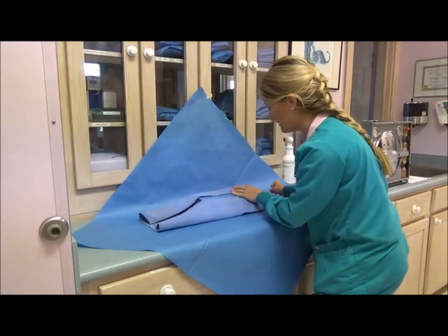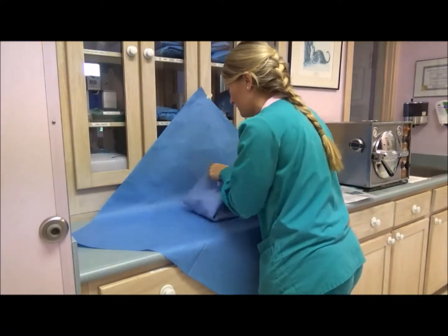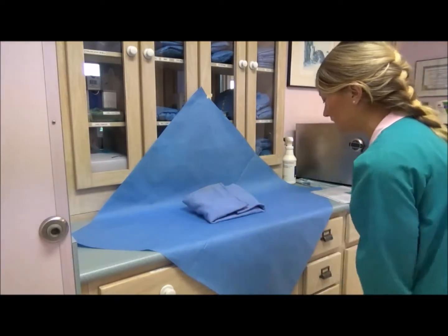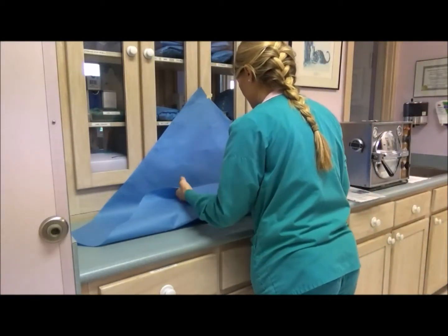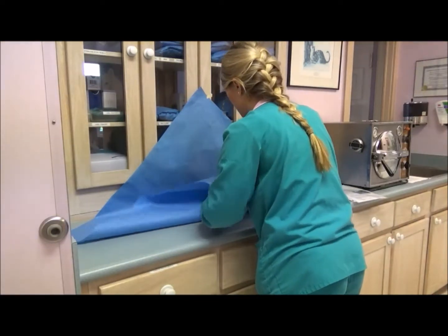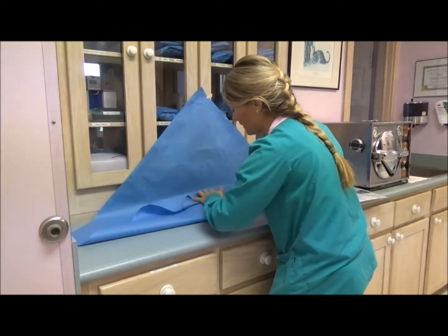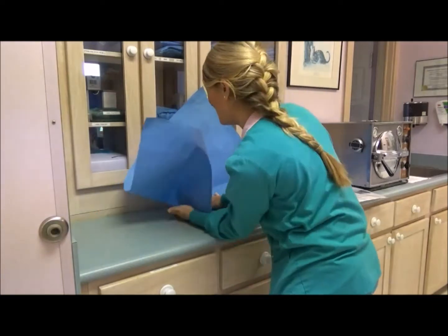And you fold it in a manner that makes it easy to open up once you're opening up the sterile pad. So that's good. And now I'll proceed to fold in the drape and use the angled folding method here. Basically, this way you're making little pull tabs that make it easy to open up. Leave that there for a minute.